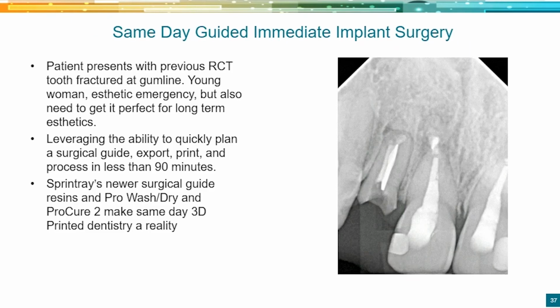So let's take a look at an example of a same-day guided immediate implant. Patient presents with just a fractured off tooth. We've all seen this, right? Anterior tooth, kind of a small root, root canal.